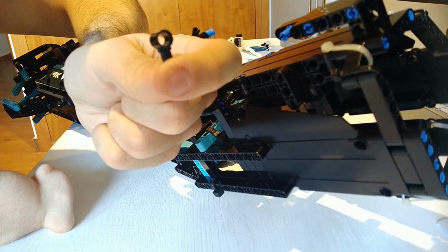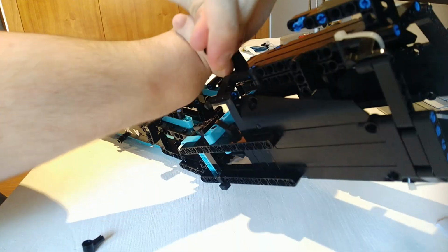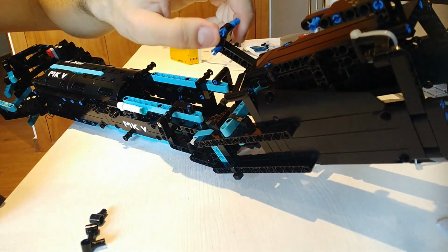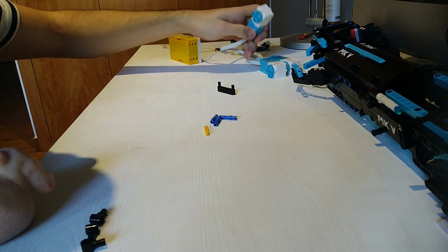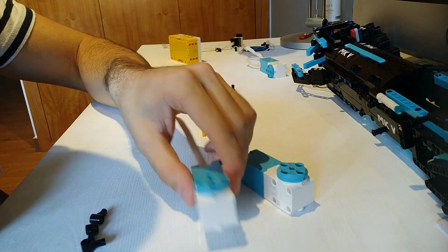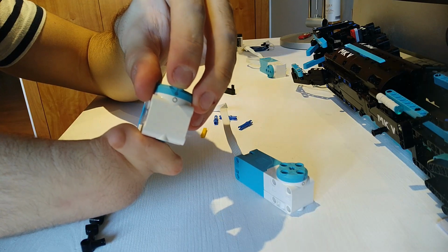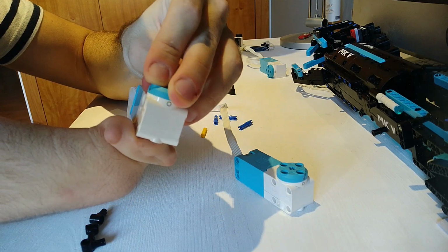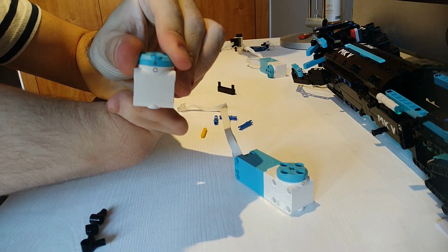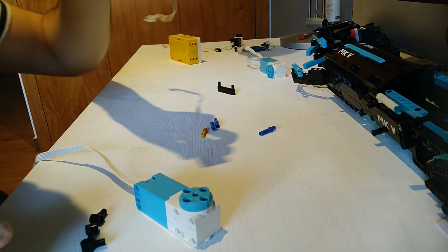The next step is to get the prosthetic and remove these bricks right here, only the black ones, only these ones, in order to connect the 2 motors that go in here. Now you're going to grab 2 motors from the Spike Prime set and you are going to watch out for this. This is an indicator, so you're going to need this aligned. You don't start building like this, you actually need to pull this manually in the center. So it should look like this, completely aligned. And the other motor should look like this as well.